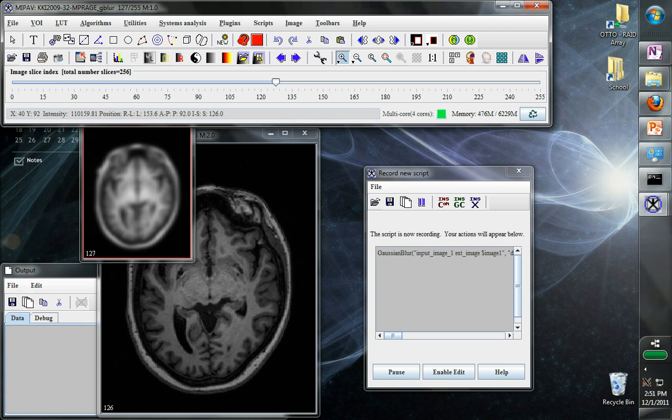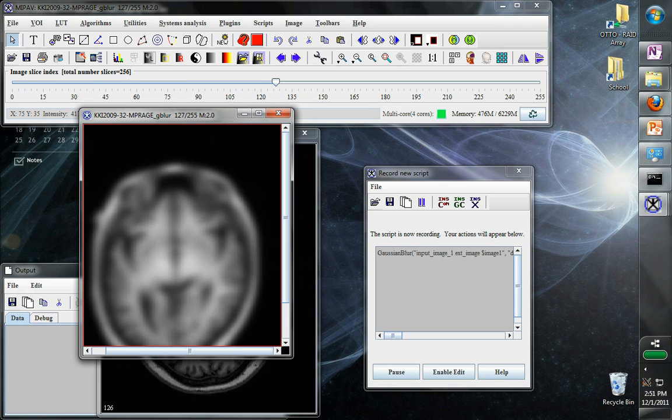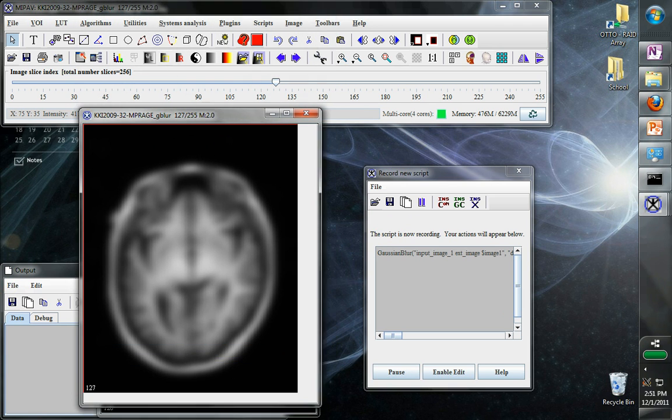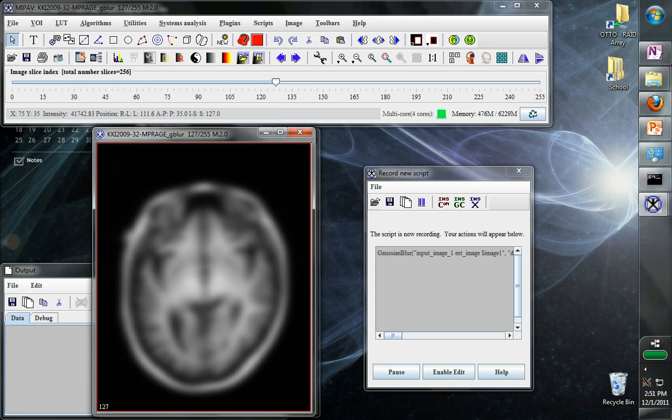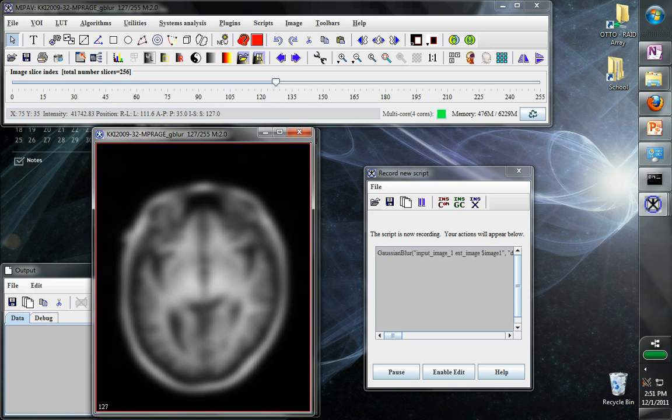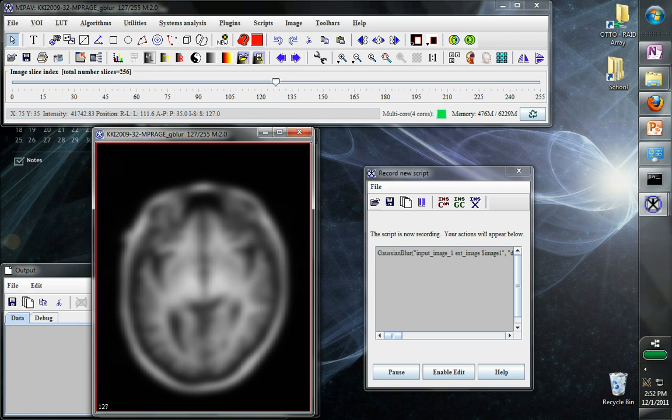That will bring up the results here. We can make the results bigger. Notice that MiPav recorded that we blurred the image, but it didn't record that I made this image larger because for the processing steps, we don't really care about the steps that we've just done in the GUI. We care more about changes in the image itself.